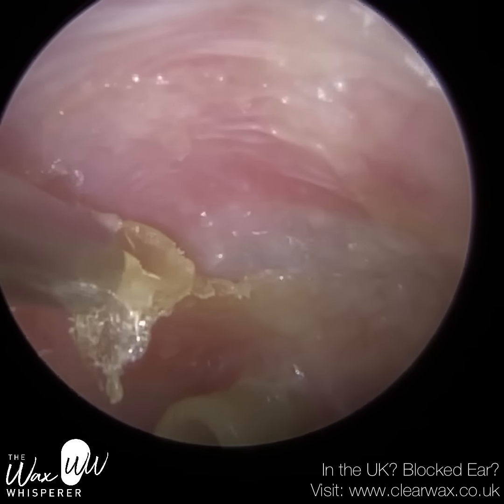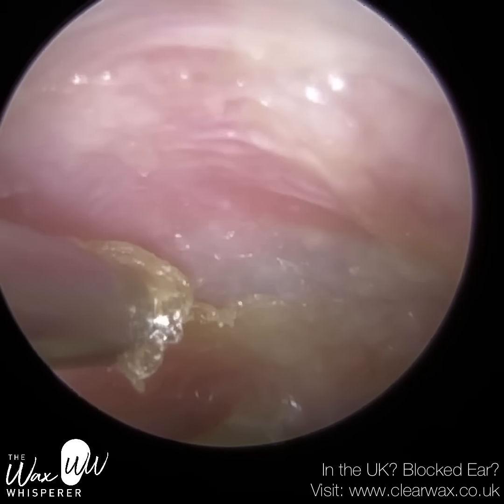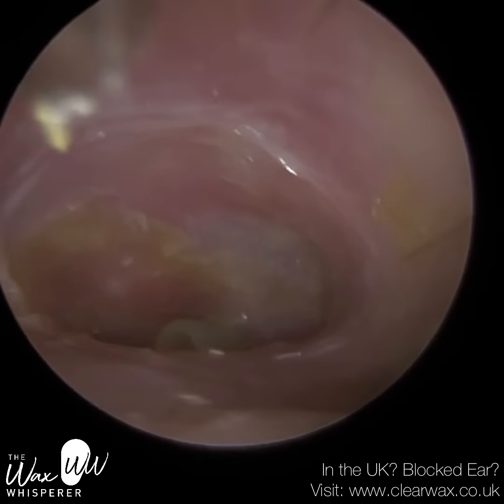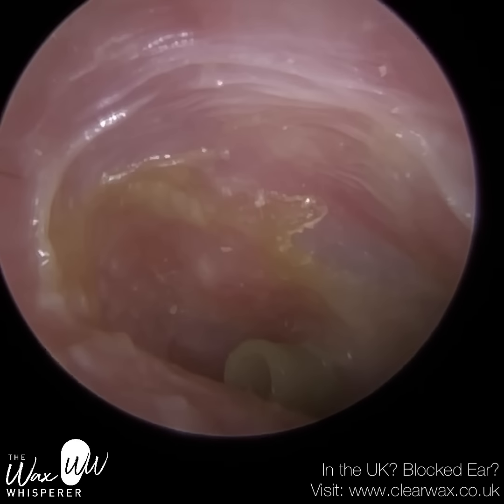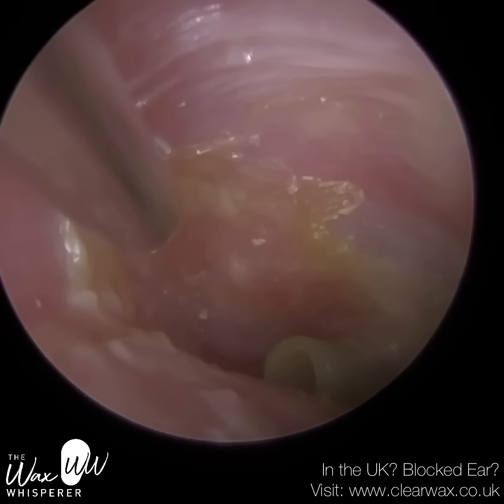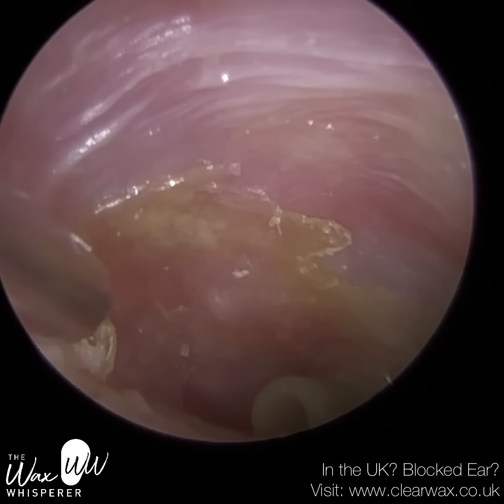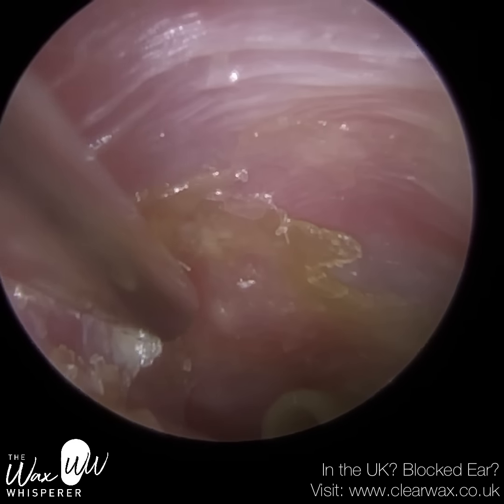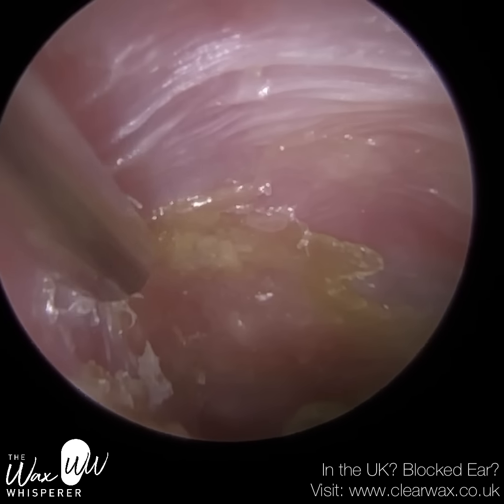You can just see here, I'm just delicately trying to peel this skin directly off the eardrum. It's crusted. Now, when we peel this off, we've got to be careful that we don't dislodge that grommet, because this skin can grow around the grommet. So when you're peeling skin off the eardrum, sometimes it can dislodge the T-tube, and we don't want that to happen. So I'm just going from the top of the ear canal, and I'm just going to peel down towards the eardrum, and then you'll see in a moment I managed to peel this crusted skin off the patient's eardrum.